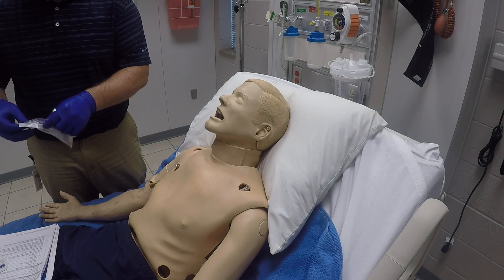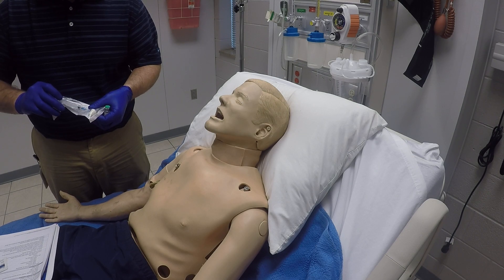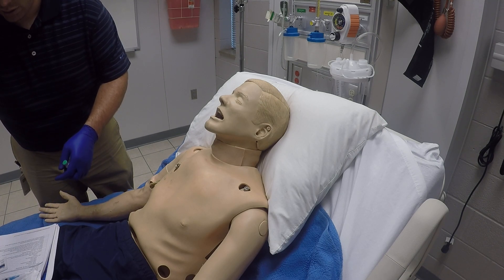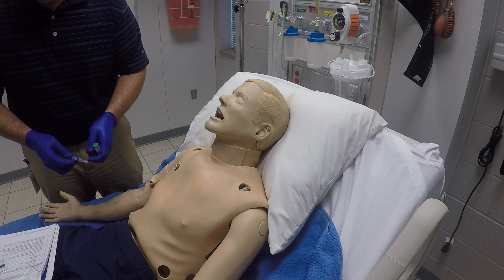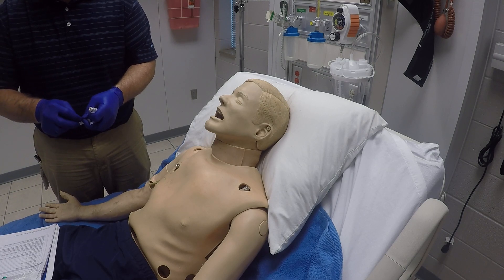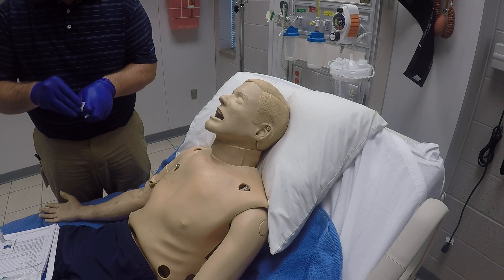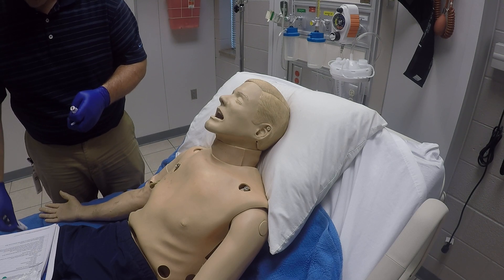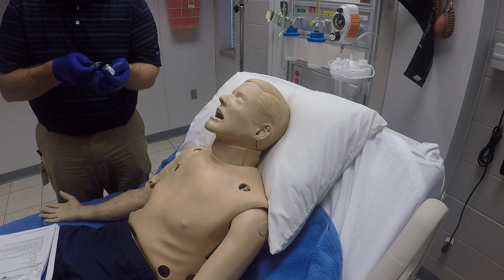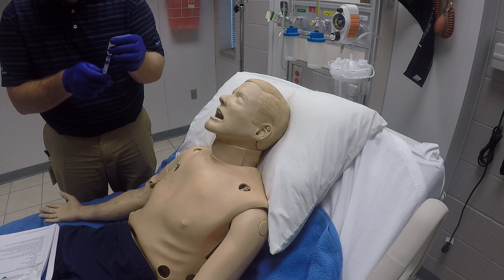We're going to take our syringe and needle out of the package — this is a pre-packaged syringe and needle with the atomizer device as well, all in one package. We've got the syringe and needle already attached. We'll take the top off our medication, take our alcohol swab and clean that up, then go ahead and draw up half a milliliter of medication. Insert some air and draw out what we need.